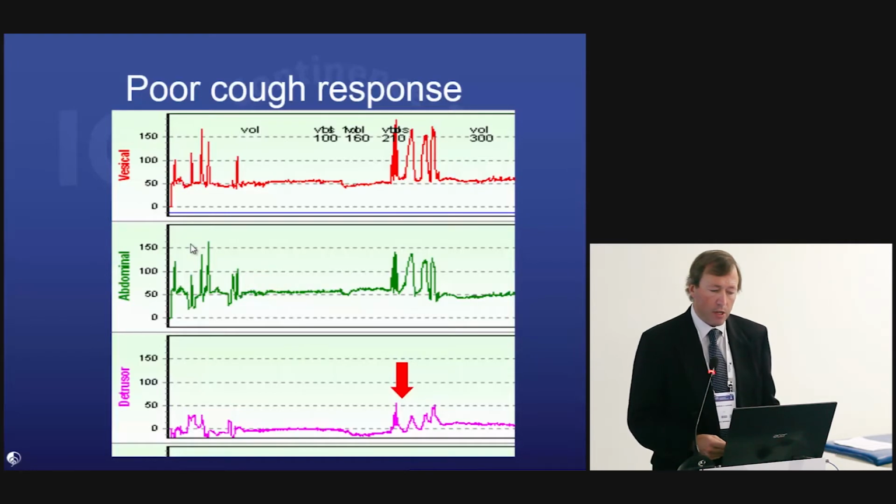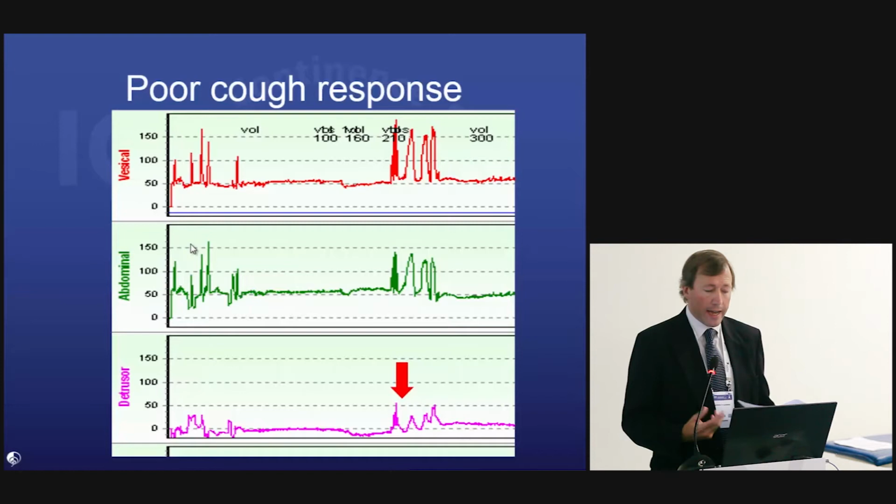The answer to that would be to flush through your abdominal line a little more, put a bit more water in, and ask for another cough. And that should resolve your issue.